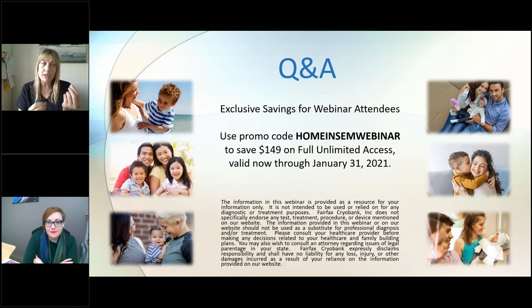If you notice that there's a little bit trapped in there, you can always pull the plunger back and then just push a little air into the vagina and it'll get out that last little bit. I mean, that's what I would do. It's very, very precious, and each little drop has, I don't know, a million sperm in it. So might as well get that last little drop, but then you can remove the syringe.